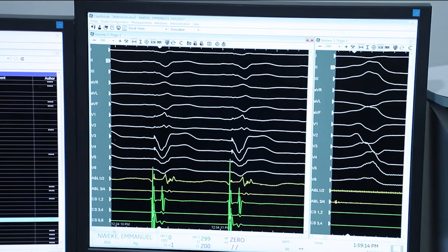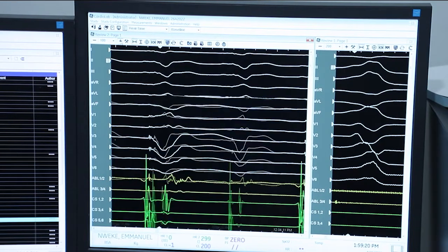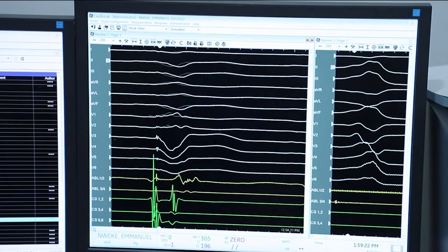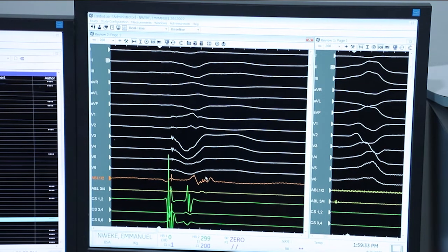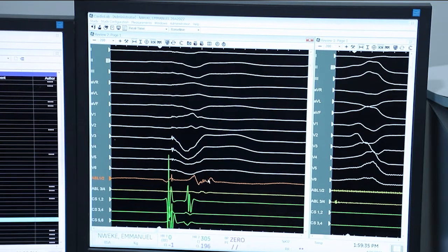Again, here is the endocardial site of the LV summit, and during sinus rhythm you could see clearly that a post-systolic potential, or late potential, fractionated potential is present, and this is a very good site, a target for ablation.